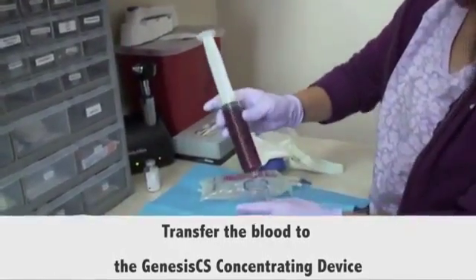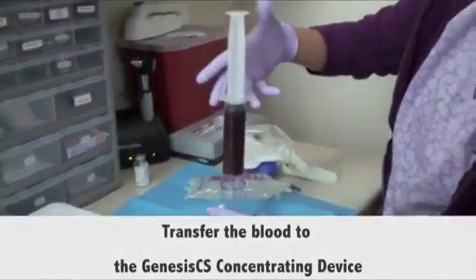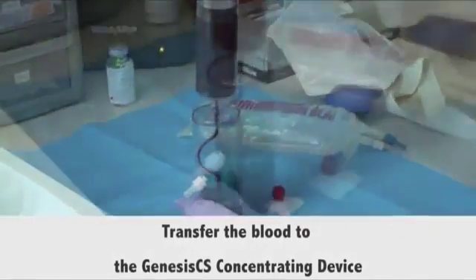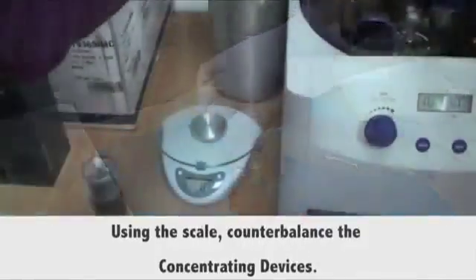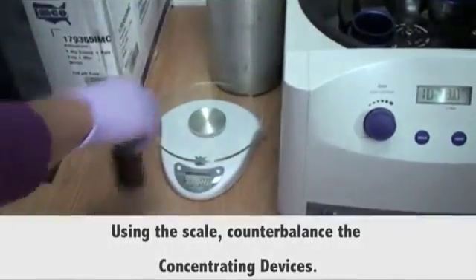Transfer the blood to the Genesis concentrating device. Using the scale, counterbalance the concentrating devices.